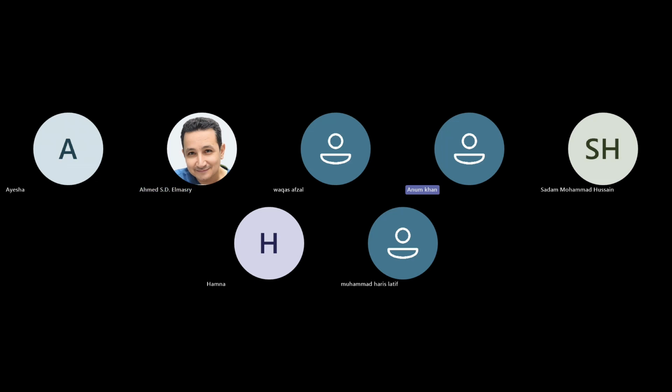Yeah, there are two ways I have also seen. Some people leave the sheath over there and just remove the intra-aortic balloon pump. They feel that if they leave the sheath there, they can reinsert it. But personally, I would say leaving the sheath there won't be beneficial because there are chances of coagulation. And when you put another balloon, it's preferable to puncture again. Maybe they leave the sheath to avoid multiple punctures, but I don't think it's a very safe practice.